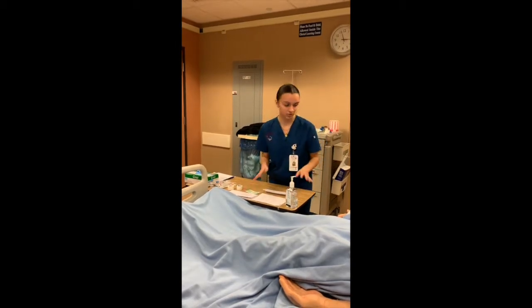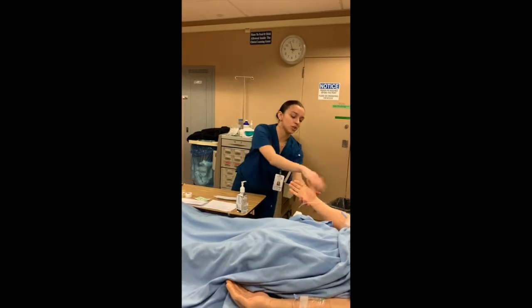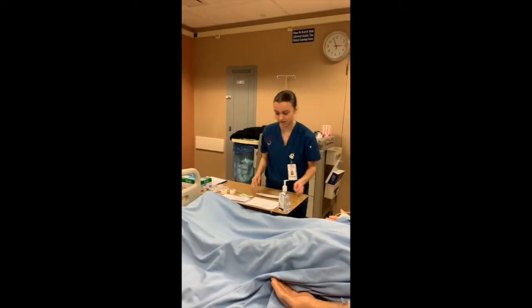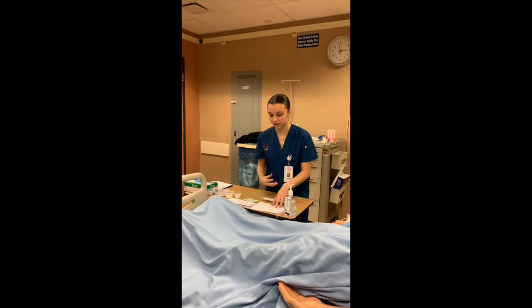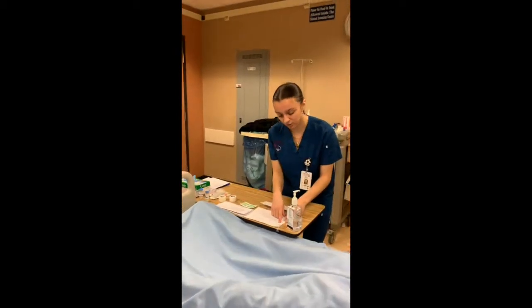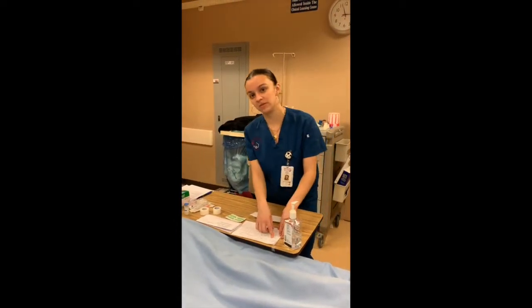I'm also going to confirm that in this situation Mr. Mancini does not have an armband, but you would check his armband for his number and his name as well. So it was Mario Mancini. I'm also going to check the MAR to double check that the medication is correct with the doses and the frequency of time. So basically we have, first medication is heparin. Heparin is going to be given 5,000 units per 1 milliliter, and it's going to be given subcutaneously.